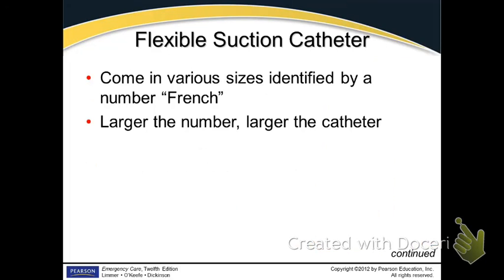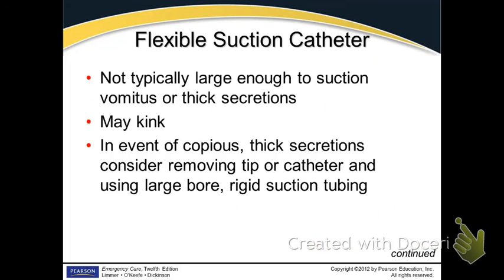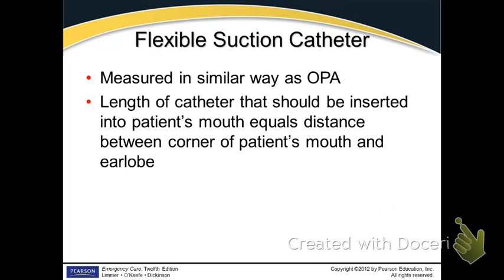And also the flexible or French suction device. You can have these in larger bores, but that particular one that you're looking at is rather small. They kink, they won't suction large secretions, and they get clogged up very easily. So it's only a last resort if someone's clenched down, like having a seizure and their teeth are clenched together, or you're going down the nose. When you guys get up and practice this in a few minutes, you'll see how it works.